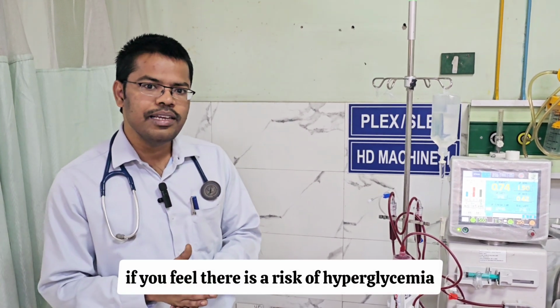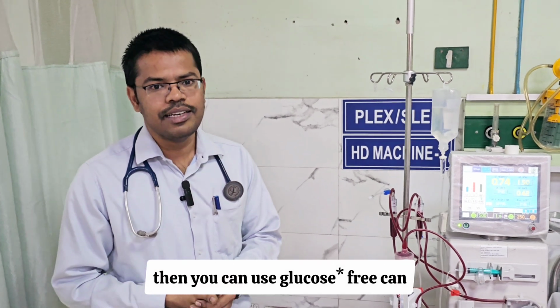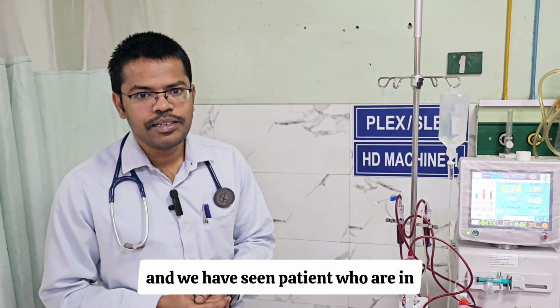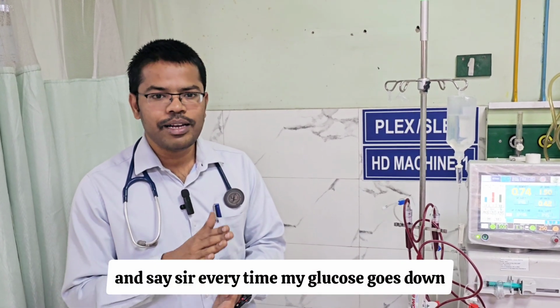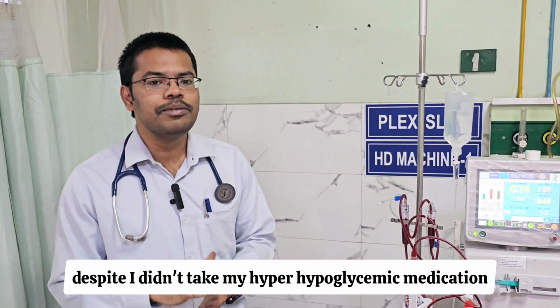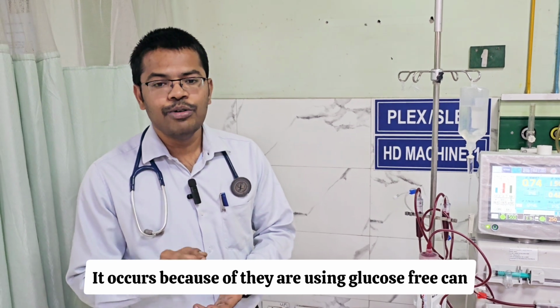When to use that? In a diabetic patient, if you feel there is a risk of hyperglycemia, then you can use the glucose-free can. So it is a special entity where you have to use it in a hyperglycemic patient, not in all. And we have seen patients who are in primary care or secondary care dialysis centers. They come to the OPD and say, "Sir, every time my glucose goes down, despite I didn't take my hypoglycemic medication." It occurs because they are using the glucose-free can.